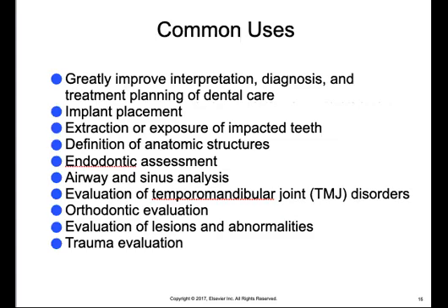Some common uses for this type of imaging are the following. CBCT imaging applications greatly improve interpretation, diagnosis, and treatment planning in some aspects of dental care.